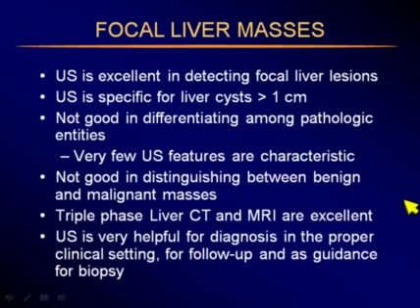Triple phase liver CT and MRI are excellent modalities for this, but we are good for picking up a focal mass, and we are also very helpful in the diagnosis in the proper clinical setting. We're good for follow-up and as a guidance for biopsy.